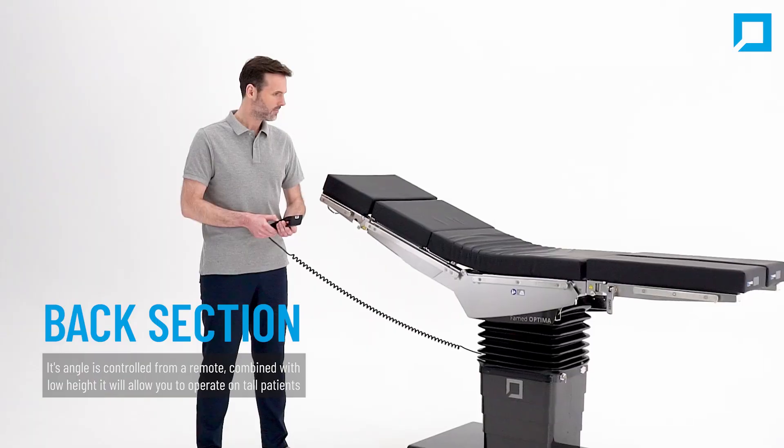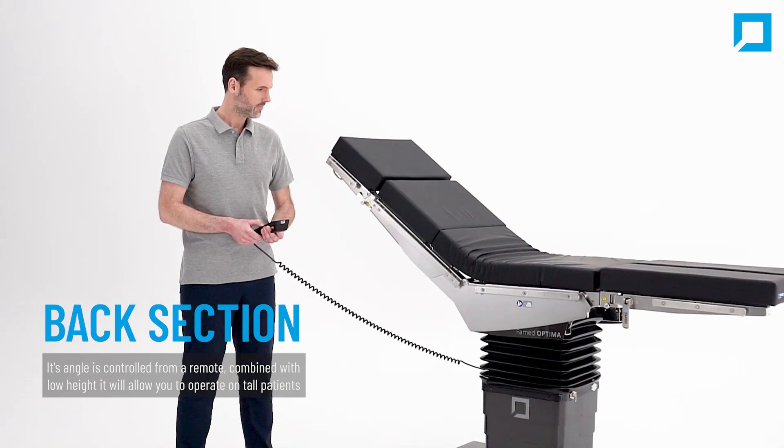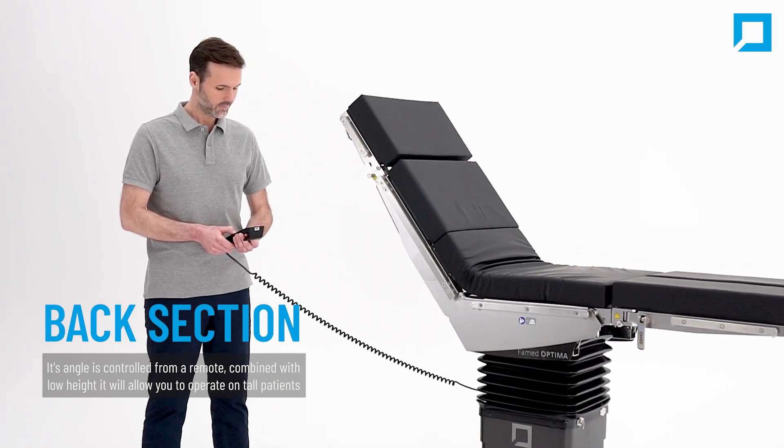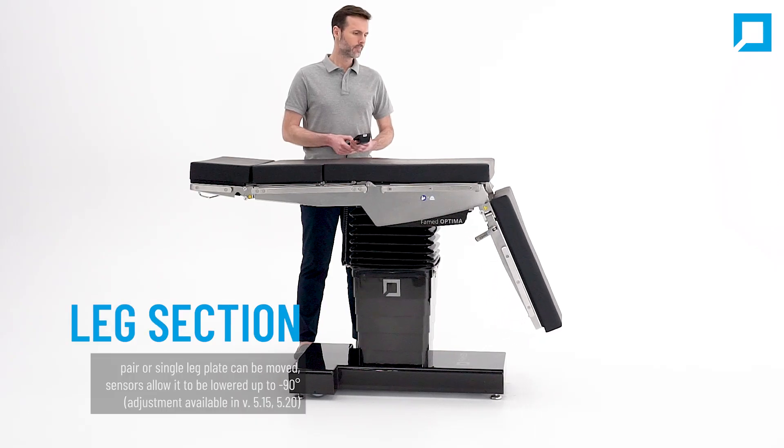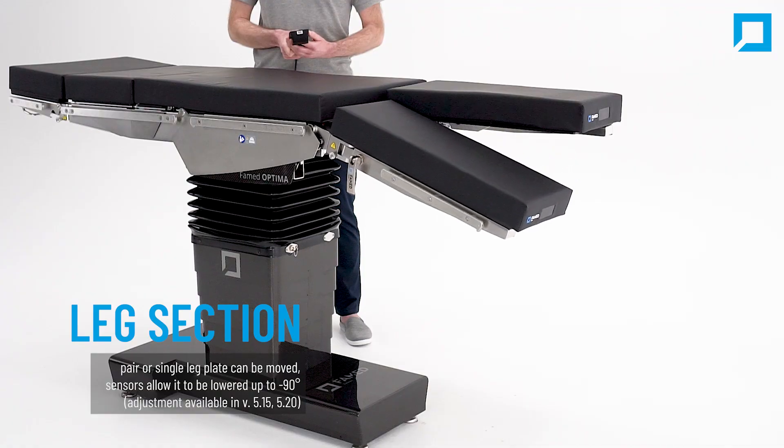The back section angle is controlled from a remote — a feature that, combined with the low height, allows you to operate on tall patients. The leg section pair or single leg plate can also be moved using the remote.